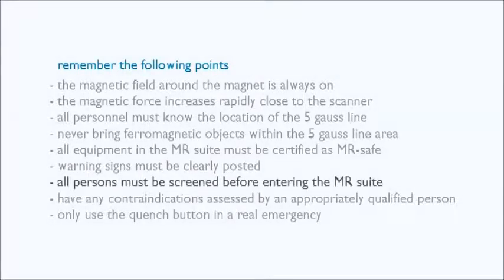All persons must be screened before entering the MR suite. Have any contraindications assessed by an appropriately qualified person. Only use the quench button in a real emergency.